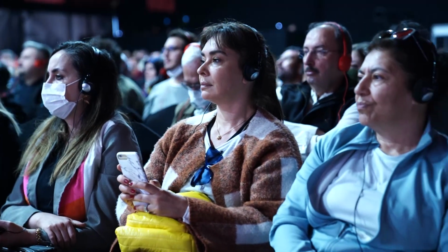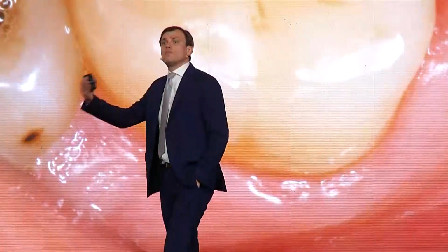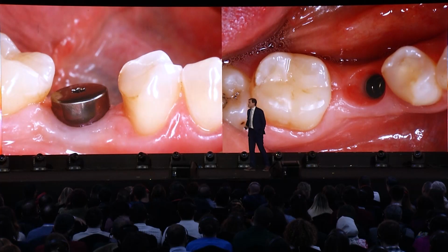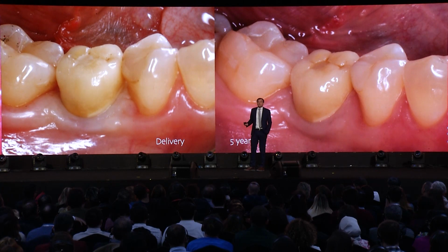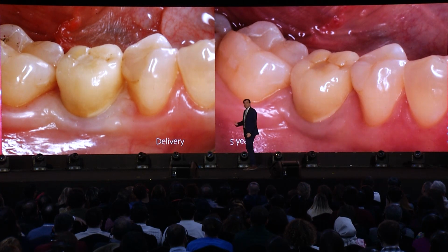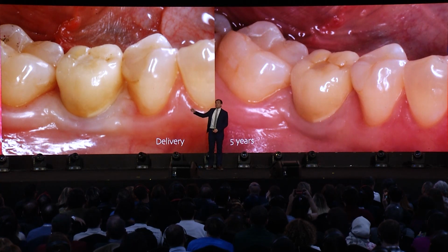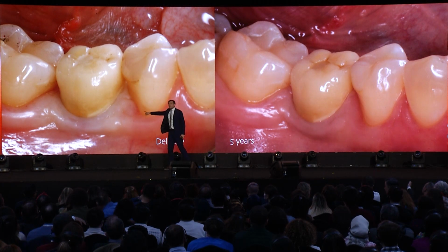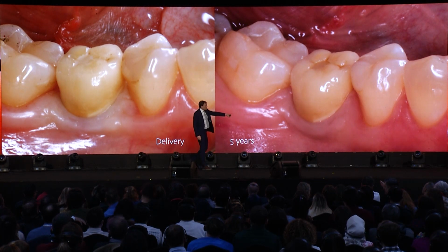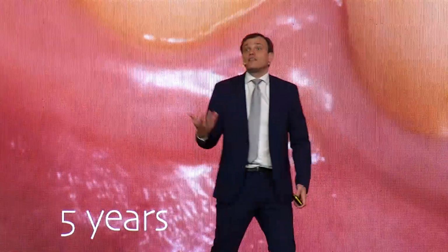And I put those restorations on the implants and then followed them up for 5 years. The patient came back after 5 years. It was interesting to see what we were going to find. From a clinical point of view, there was no difference. You can see the delivery image and the 5 years follow-up. Of course, we see the tissues getting thicker, so an ideal soft tissue situation.